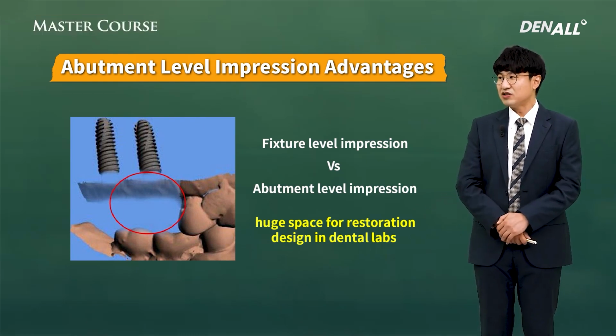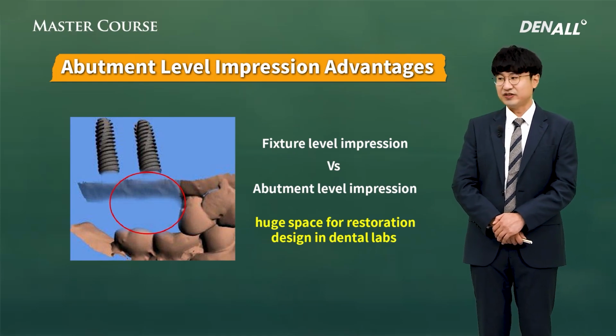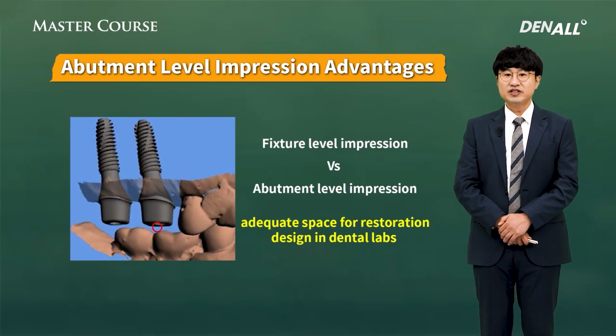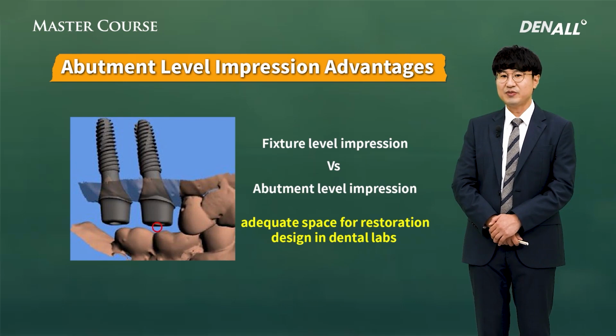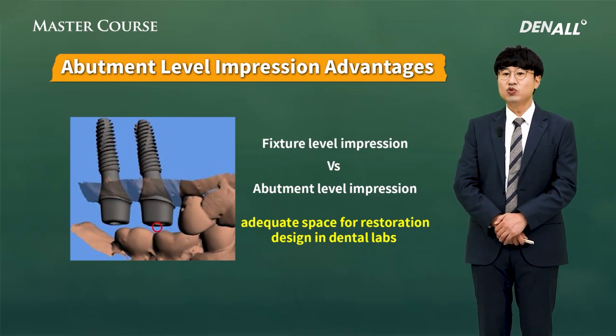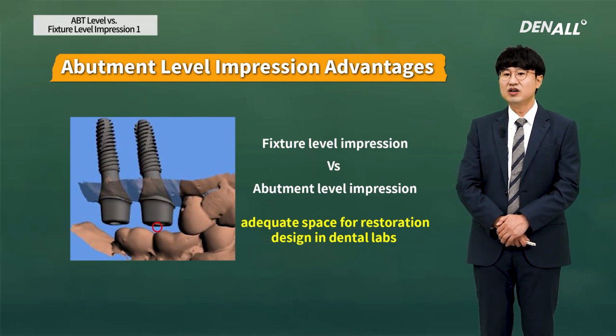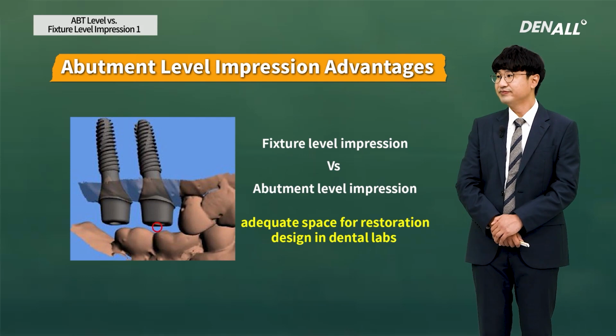Sometimes it can be very challenging for me. However, after connecting the abutment, if we can take an impression of the abutment like natural teeth, it's very familiar to many, and as the amount to be controlled is very small, you can obtain very good results.